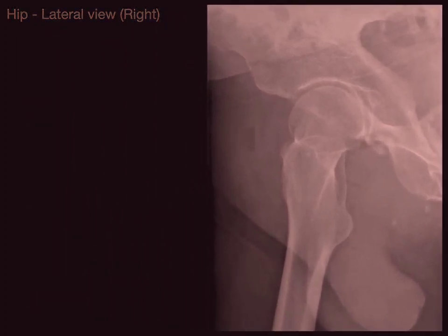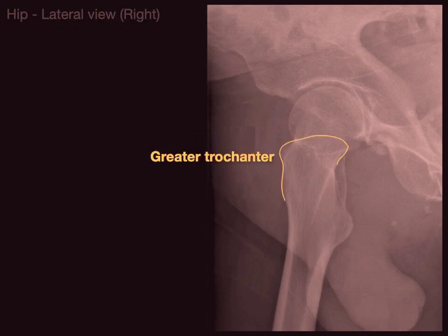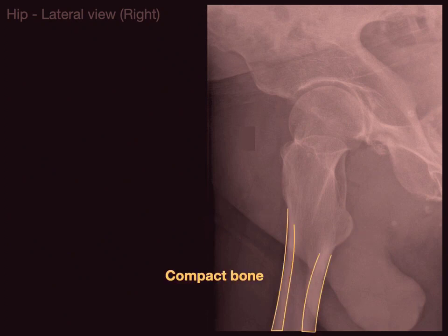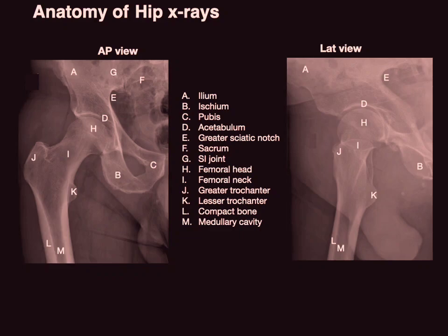On this lateral view we can see the ilium, and then the greater sciatic notch on the ilium. There is the spine of the ischium, or ischial spine, and below that is the lesser sciatic notch. The whole structure here is showing the acetabulum, and there is the femoral head with the hip joint — the synovial ball-and-socket joint. Coming off the femoral head is the femoral neck, with the greater trochanter, giving appreciation for how large it is, and the lesser trochanter. There is the compact bone and the medullary cavity.